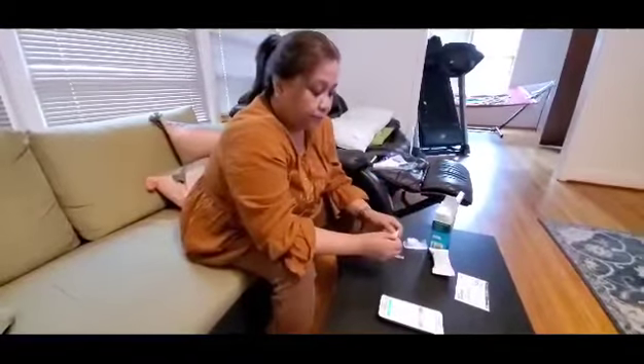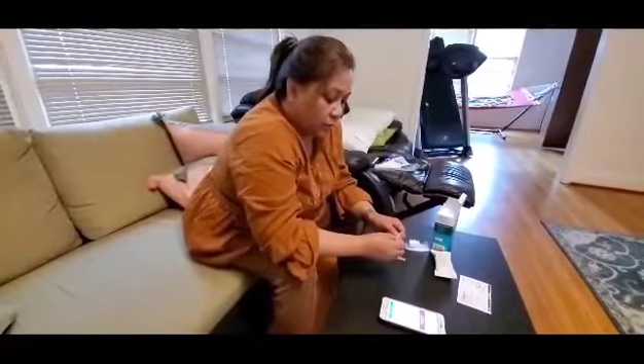Step by step — ready to start this kit instruction. Start instructions.